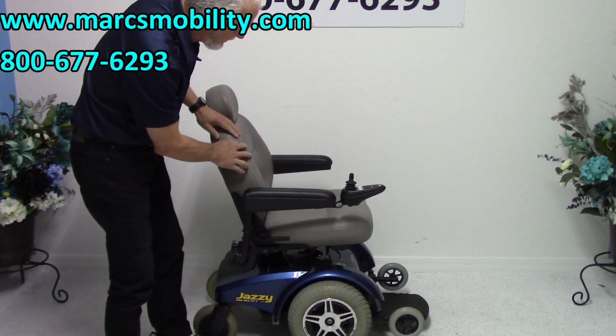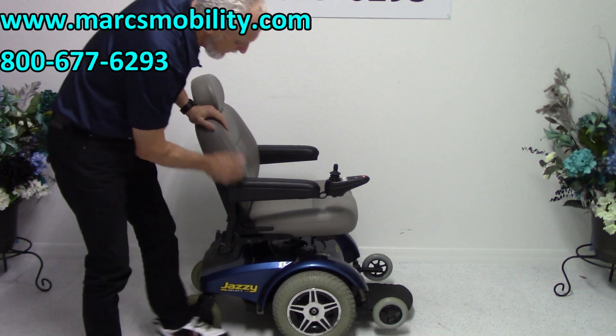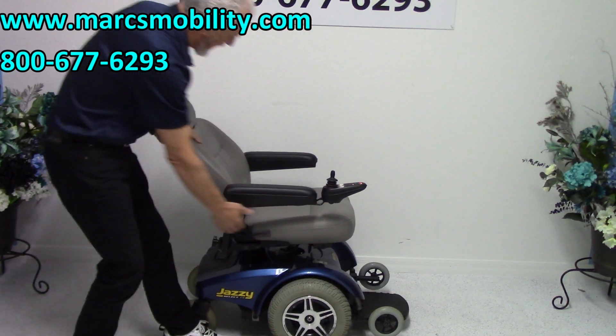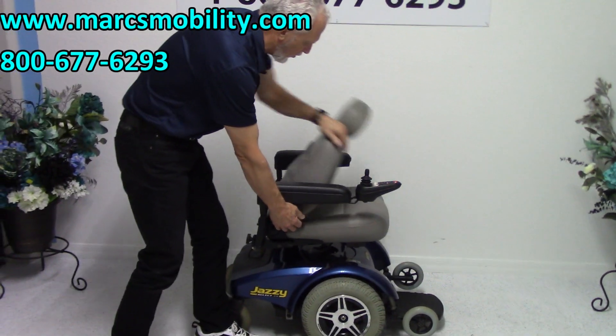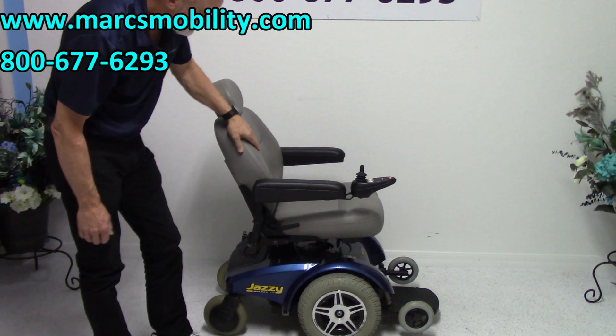It has a nice captain seat. This is one of the best seats they ever made. This is an adjustable back — you can see how far back it goes, and you can also adjust it forward to any position you want. This is one of their nicest seats.